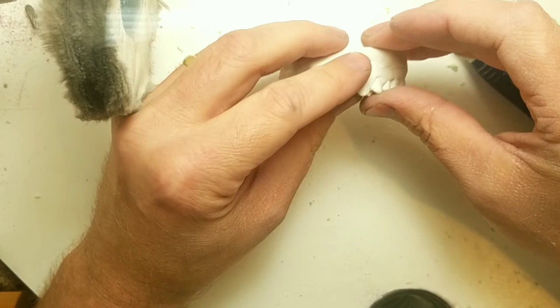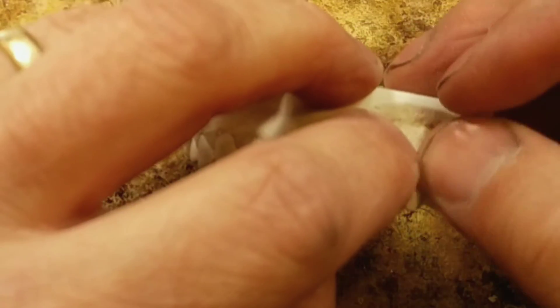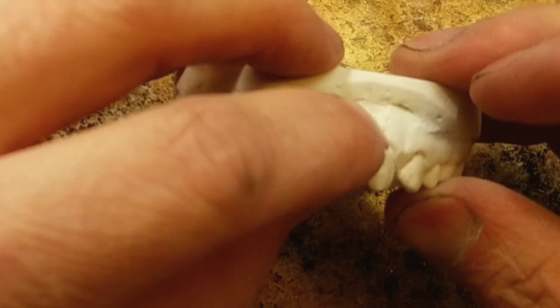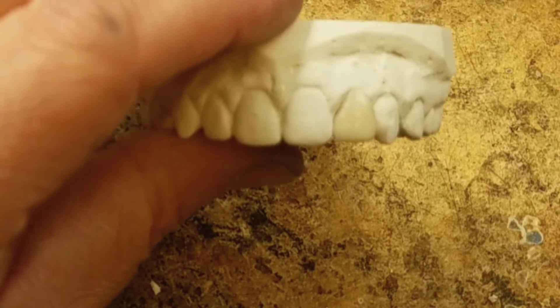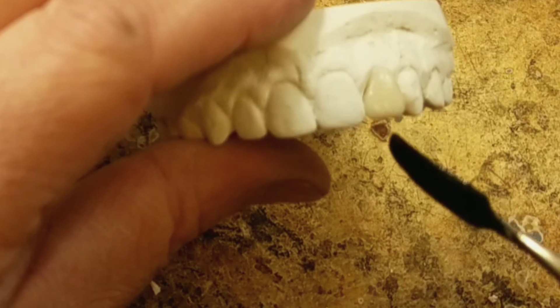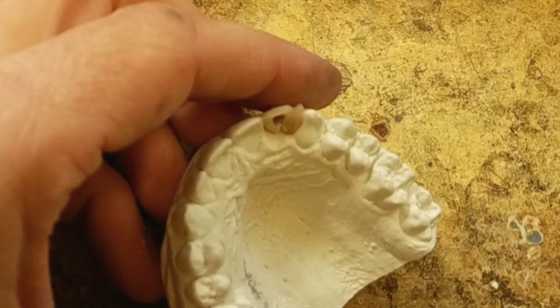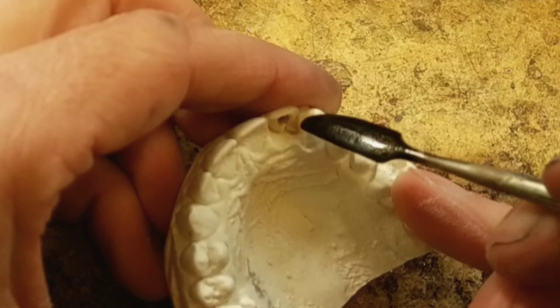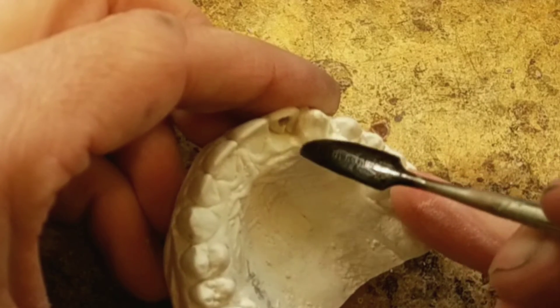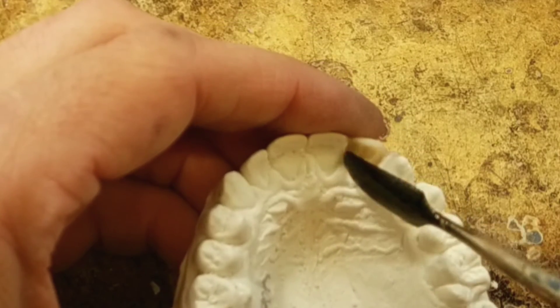Next step is to wax it in and shoot that. That's okay if it goes over — this way I can move it. With this type of wax I'm using, you just need a little bit to hold it in place. Just a touch.